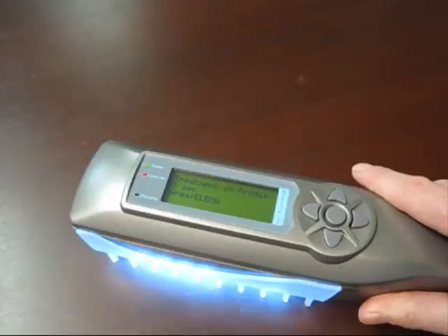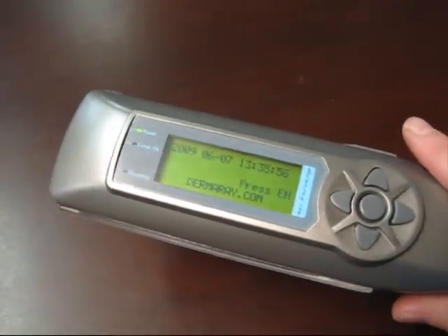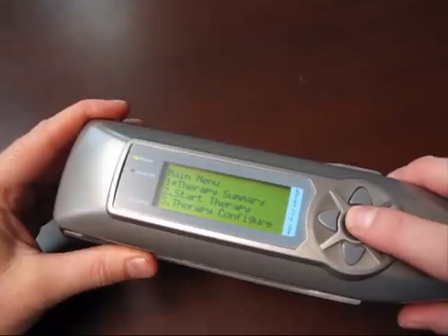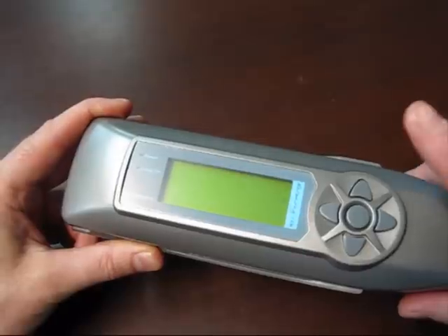Once the treatment for my elbow's finished in 3 seconds, that'll be all the treatments over. It indicates all areas completed, and it's finished. Now, if you wanted to turn off the unit, you simply hold down the enter key for 3 seconds, and it's now off. That can be recharged or put away for the day.